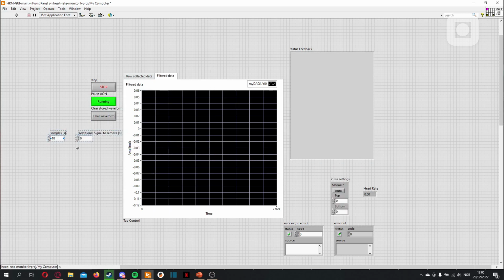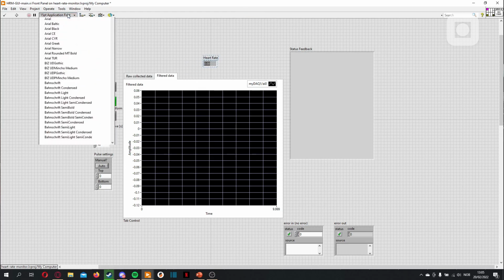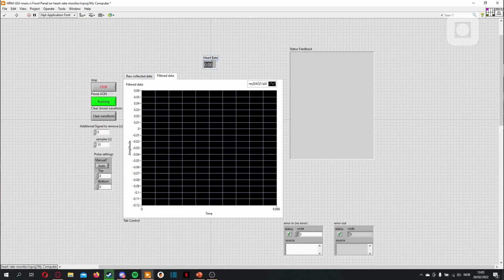And then we have these two controls. This one is a bit big, so I'll just put it in the middle. And then lastly, we have this control. I like to have my controls in one place and then have my indicators in another place. Since we have so much space now, we can also increase the size. If you want the whole thing to be increased, the name and everything, you mark everything. But if you just want the content in here, you just select the numbers and the size you want.